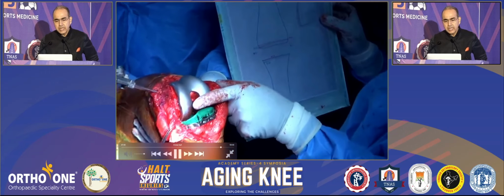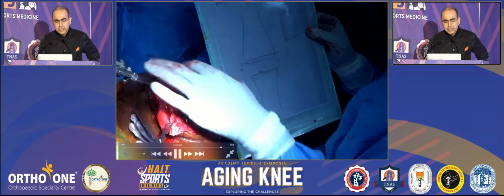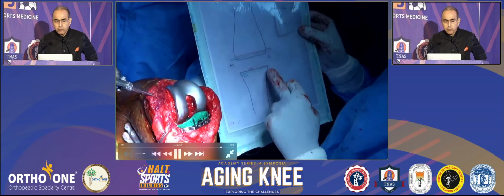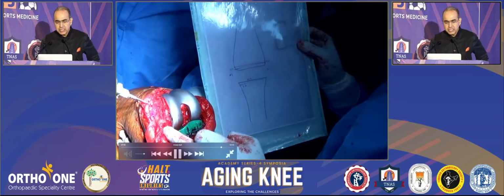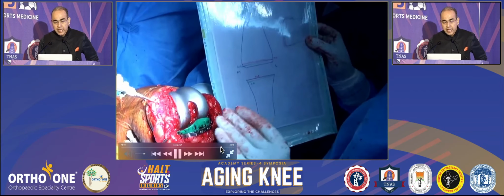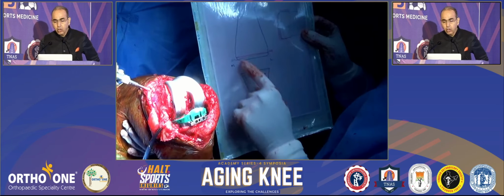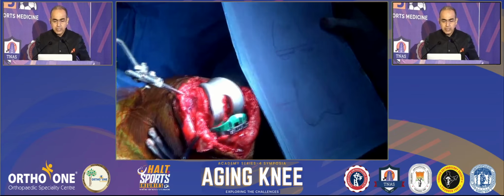So please understand that we have to restore the valgus on the femur. The rotation has to be 0 and the tibia has to start at 2 to 3 degrees varus, and 80 to 90% of your varus knees will correct beautifully by retention of the PCL and not doing any ligament release, not going behind the tibia at all. So those are the basic principles of kinematic alignment.